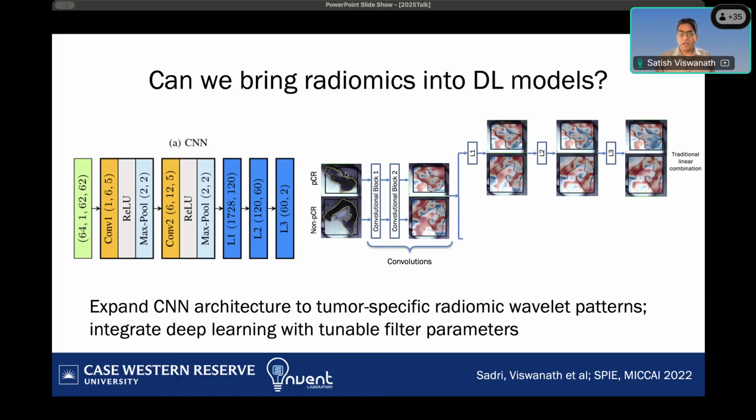So this up here, this is a patient who had complete response, and a patient who had non-response. As we run it through the layers, these heat maps should kind of start to coalesce within the tumor ROI, and you also want them to ideally be different between a responder and a non-responder. You can see how it's not that different. It's showing a fair amount of overlap. There's a lot of noise.